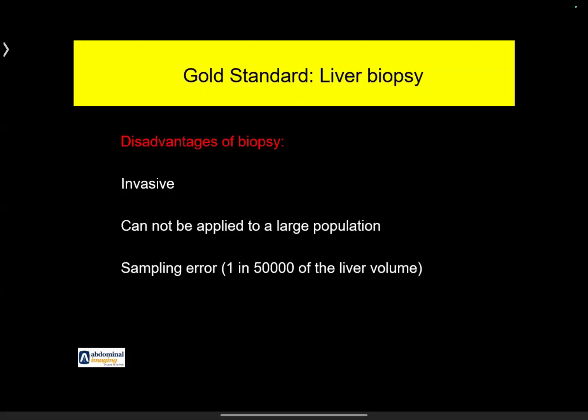except in select situations. The other thing is when pathologists give their fat percentage, they only look at the macrovesicular fat, those fat globules which are large enough to displace the nucleus. So they only take that fat into consideration and they miss the microvesicular fat. The PDFF MRI takes account of both microvesicular and macrovesicular fat, so it is more accurate.